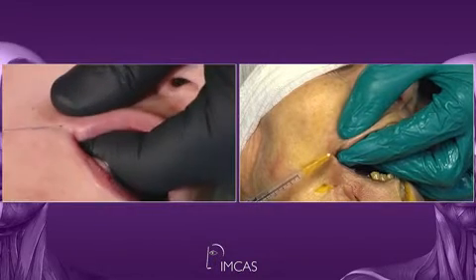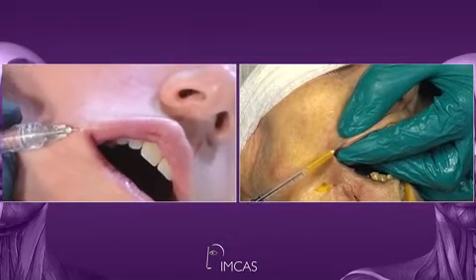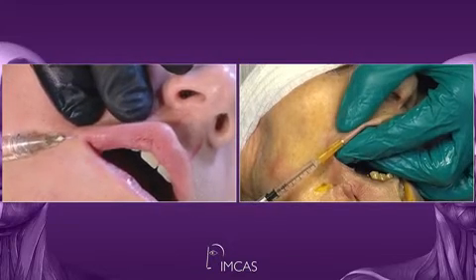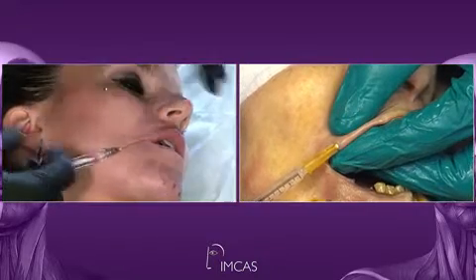Okay, so the first line, just to numb it. The second is close to the vermilion border, but not getting underneath the dermis, because that creates the white roll. And this is no volumizing. This is creating definition. This is where we treat for taking away lines.